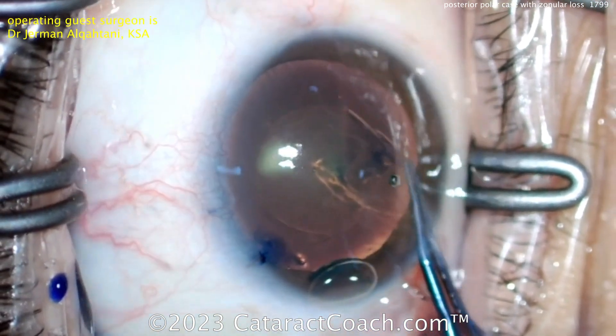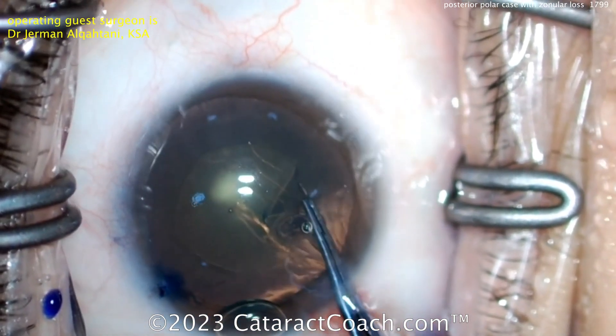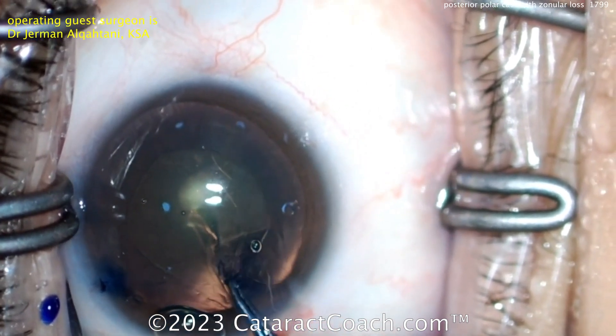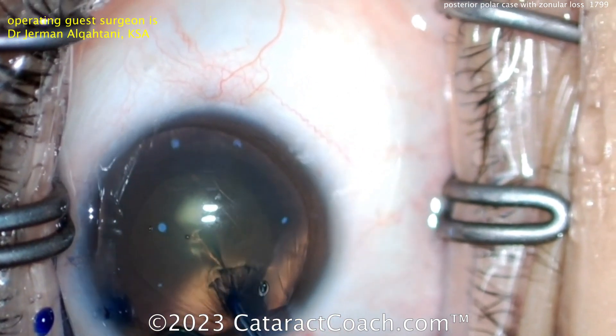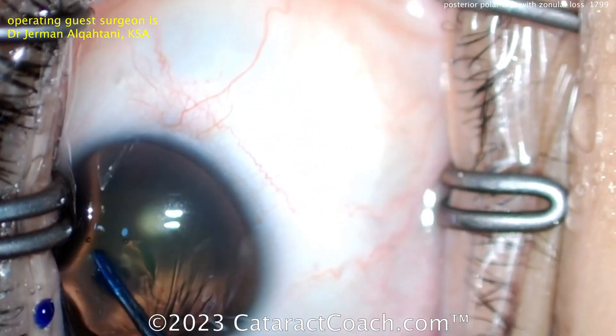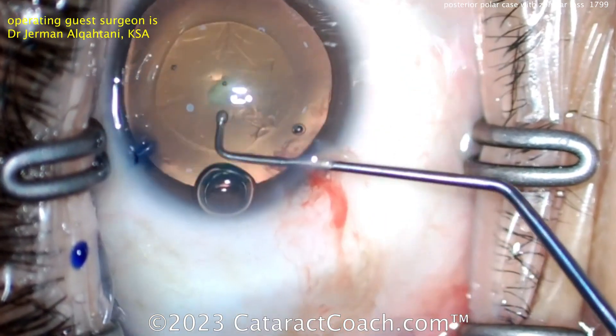We have advanced over the years and can now achieve a lower rate by avoiding hydrodissection and instead doing viscodissection or other techniques. On cataractcoach.com we have a whole section on posterior polar cataract cases with plenty of videos to learn from. There's a beautiful-looking capsulorhexis — here we go.